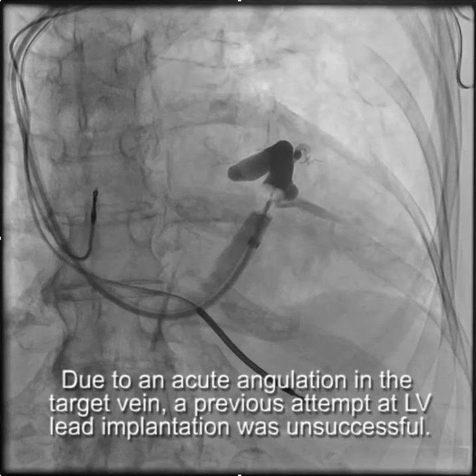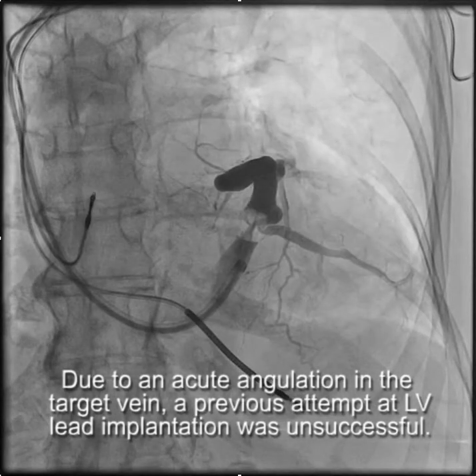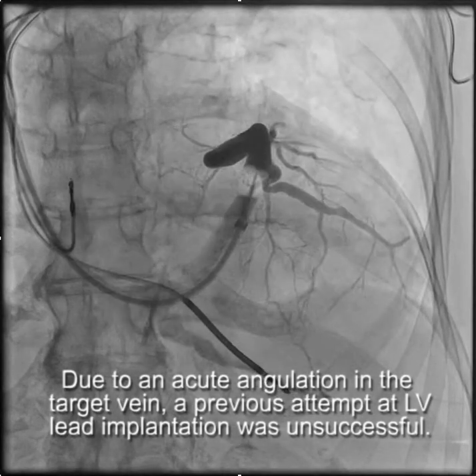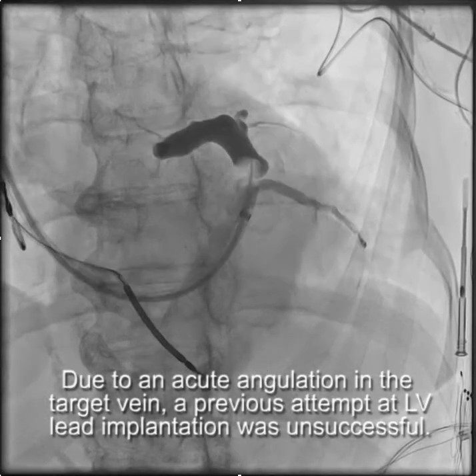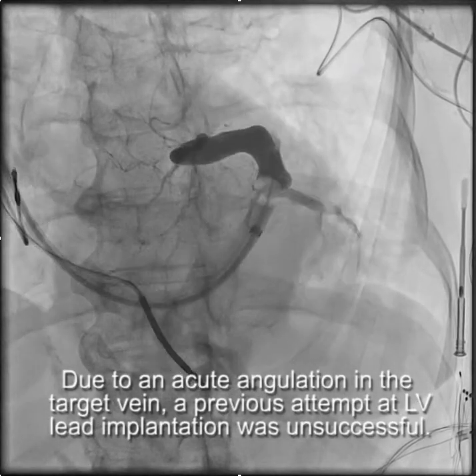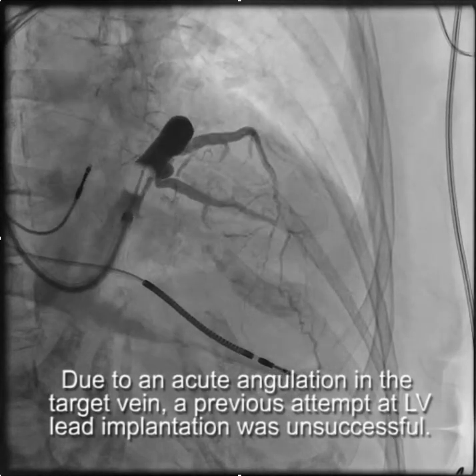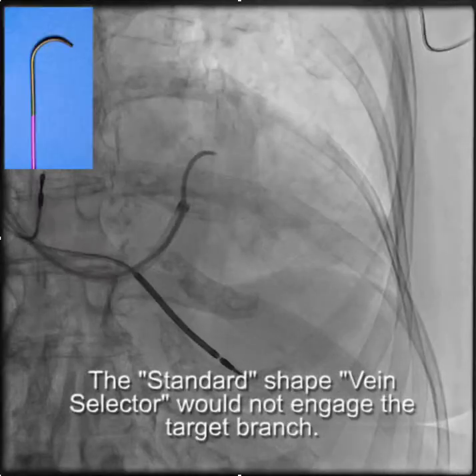We'll start with a patient that has an acutely angulated target vein. Because of this acutely angulated target vein, the original implant was unsuccessful. You can see how the target vein comes out and takes an acute angle, and there's a nice branch beyond that angle.